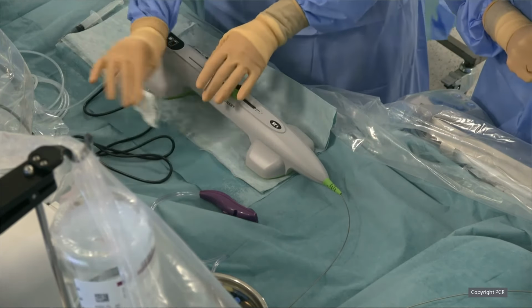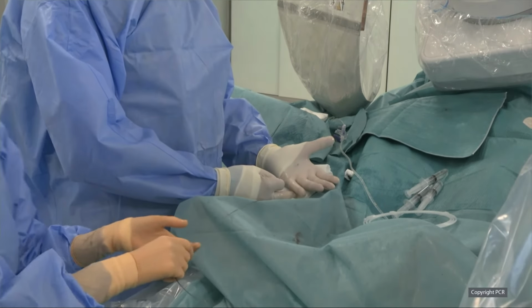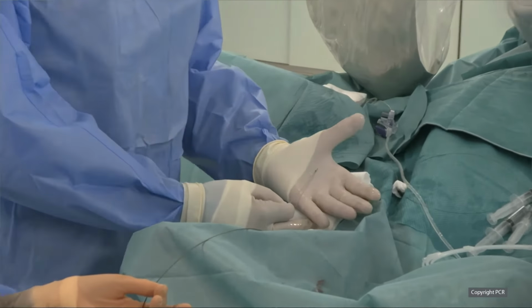It's a very important aspect of the system that it is electrically powered, so it's very easy to use. Can we focus on the hand of Javier? First do a zoom of the hands. Let's see the crown on your hand. Zoom more if you can. Yes, coming. I think you can see it now. Yeah, we see it now.